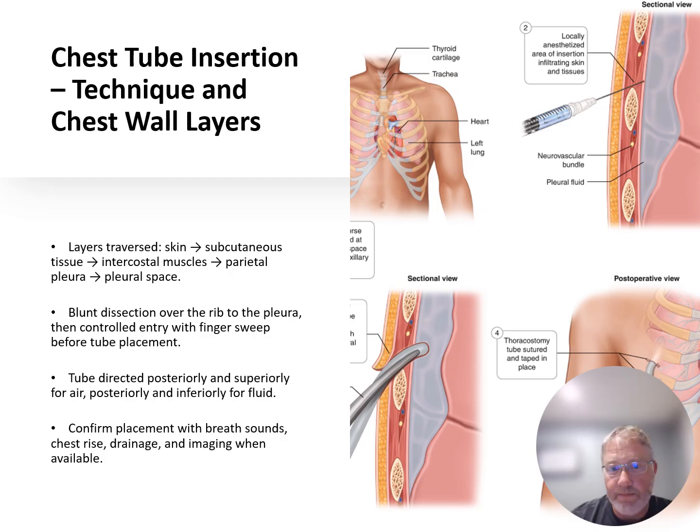In transport, always double check that the tube is well secured and that the drainage system, if there is one, is functioning properly before you move, because it's a lot easier to deal with any issues or complications of the actual setup at the stationary site rather than when you're on the road.